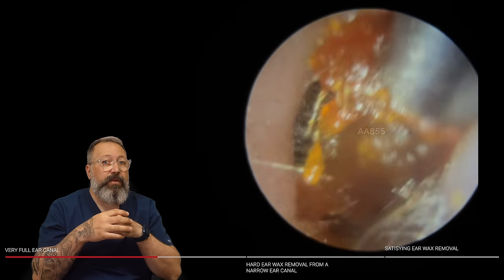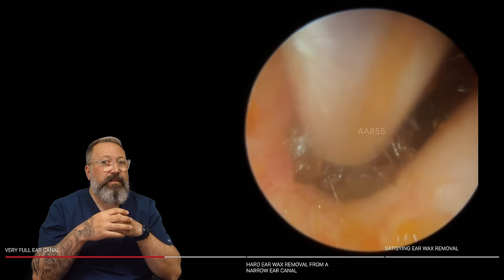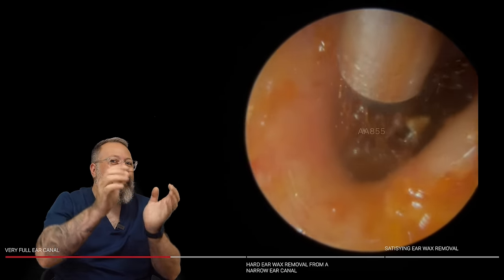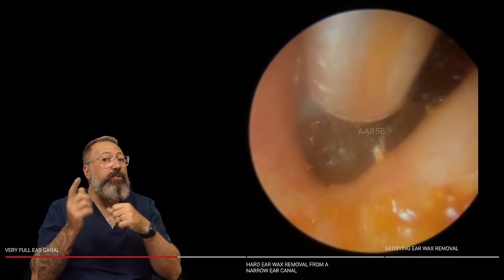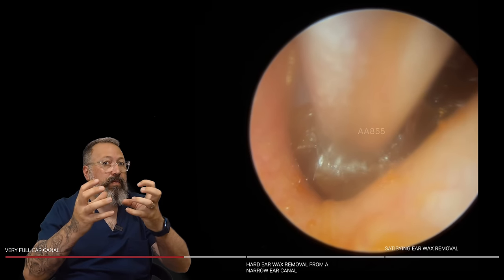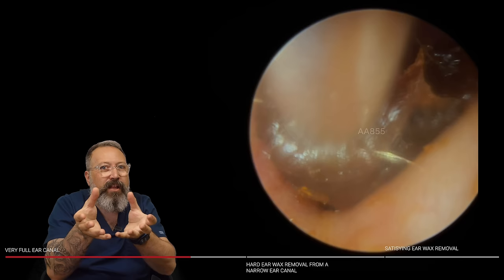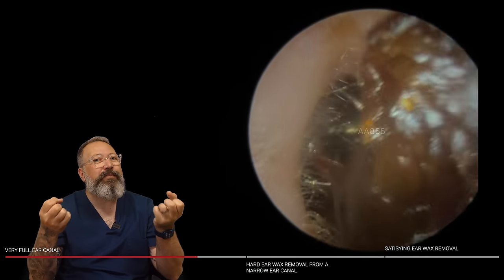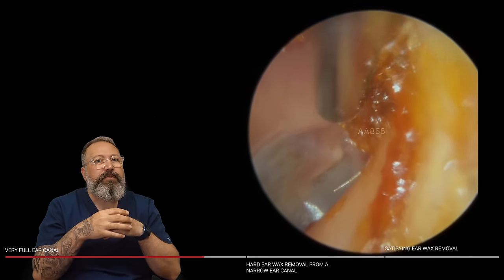If you go in here and start yanking bits off the top of it, it's going to leave a lot down in the recess, which is going to be really difficult to get out. So you can see here I'm doing very gentle little movements, trying to lift the wax a little bit and coax it out of that recess. Coming away nicely though. Out that one comes. I'm holding the suction tube and gathering the wax into that tube so we get a really good grip — very gentle movements back and forth to draw this wax out. You can see how we're using the sticky tacky nature of the wax against itself — lifting from one corner, and because it's so sticky, it wants to stay attached, so it pulls it through the anterior recess. We're just getting rid of these bits on the edge now.